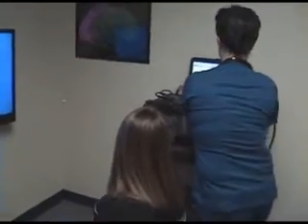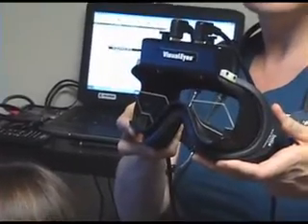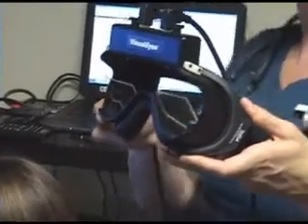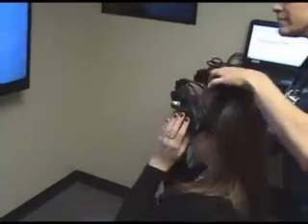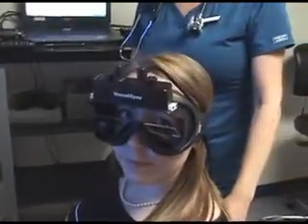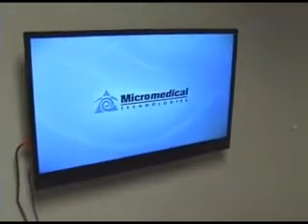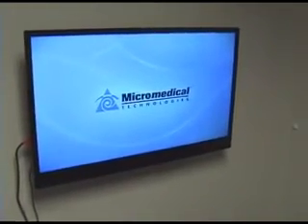So VNG is performed with infrared goggles, and these infrared goggles have little mini cameras in here that will measure eye movements, or what is known as ocular motility. These goggles are very gently placed on the patient's head over their eyes, and the patient will be able to look through the goggles. There is an infrared camera within the glass of the goggles, and the stimulus will be on this TV here, and various types of eye movements will be measured.